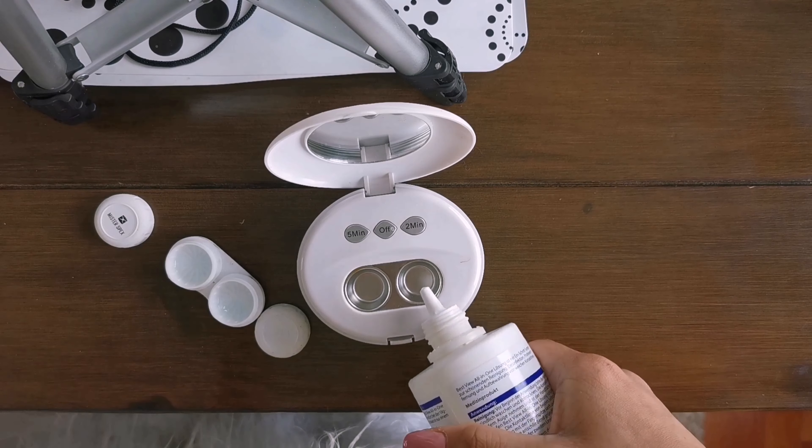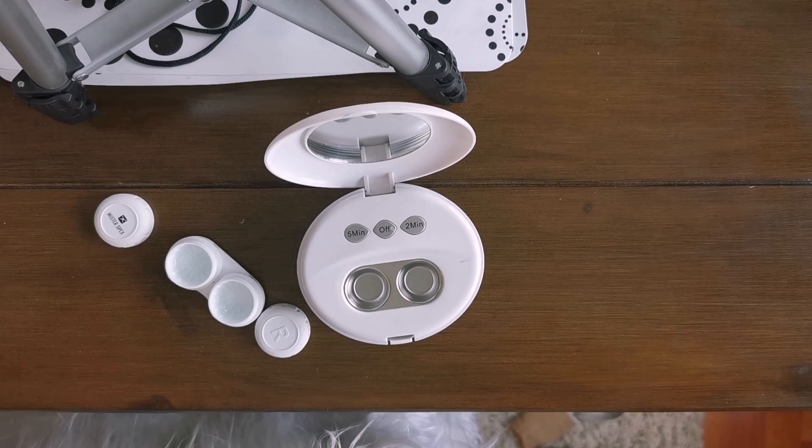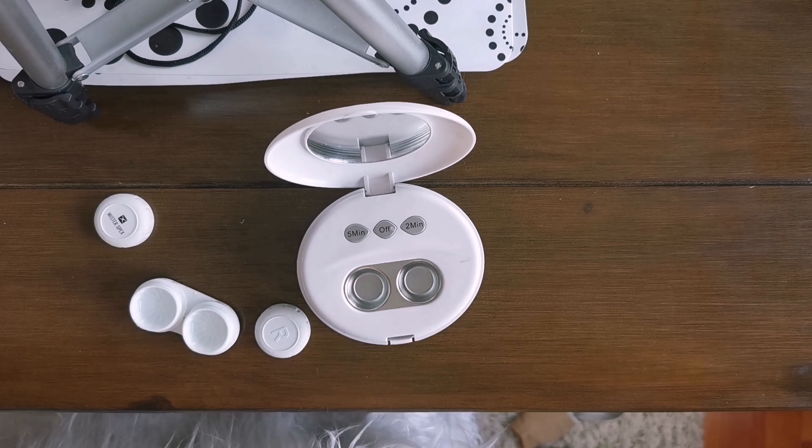So this is the device. The usual way you clean your contact lens is with your contact lens solution — you put the contact lens in. Normally I clean my contact lens with this device for one round, which is five minutes. If I don't wear it for a couple of days, I clean it for ten minutes, so two rounds.